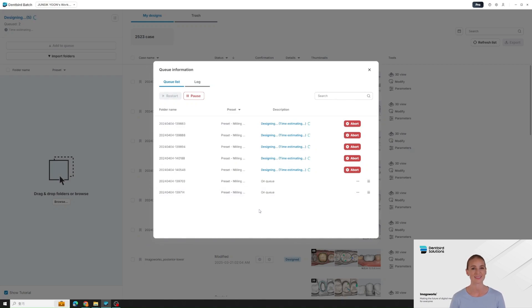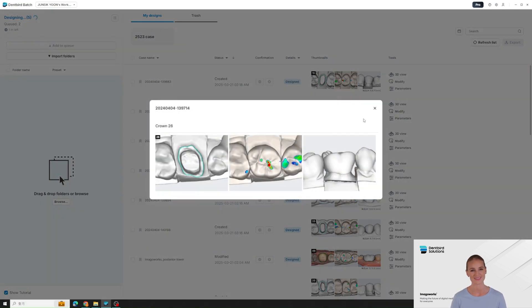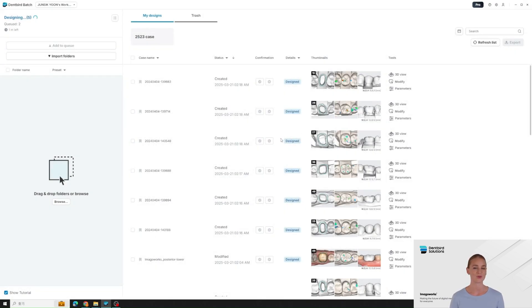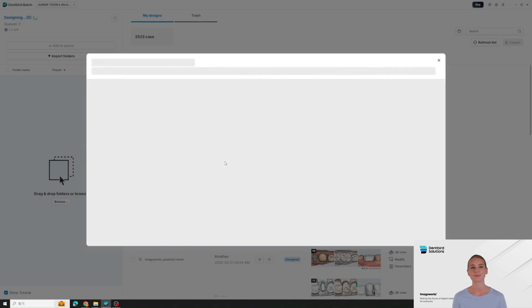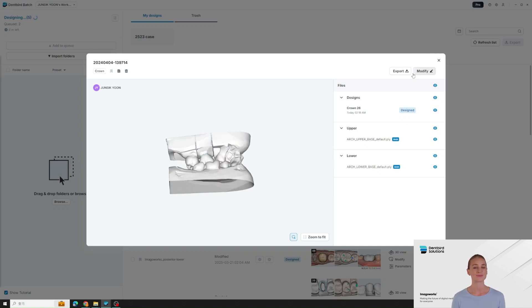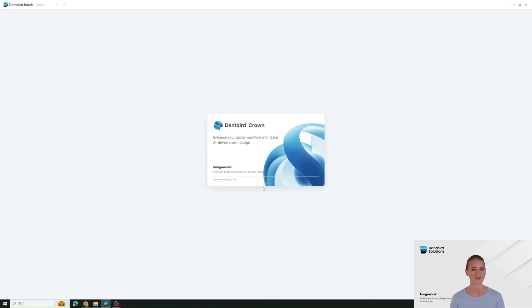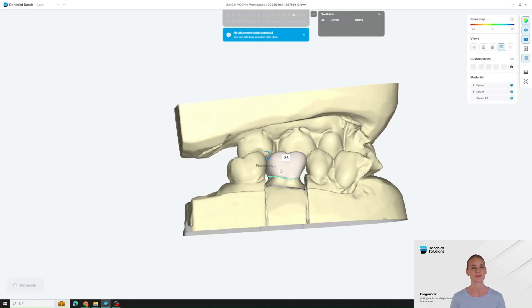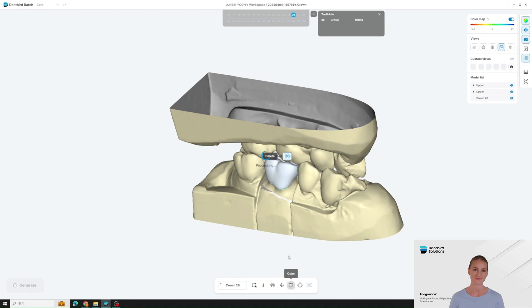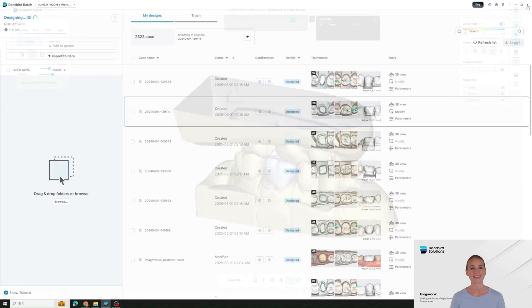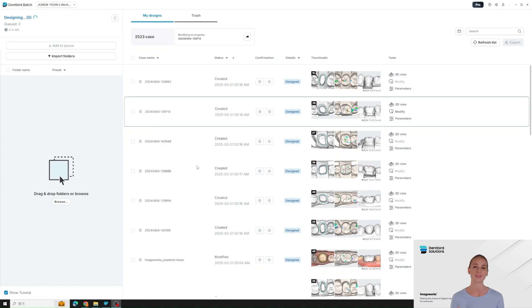DentBird processes up to five cases simultaneously, ensuring fast and efficient management. You can check your designs in 2D images or in 3D viewer. Users can review and instantly modify the design if needed. Even while you're making adjustments, the AI continues to generate crown designs in the background, maximizing efficiency and streamlining your workflow. It's already done while we were explaining the modify feature. You can work on this just like you would with a DentBird Crown. Once the design is completed, you can review the result, separate the files that are ready for immediate use from those that need further editing, and quickly proceed with modifications or download them right away.